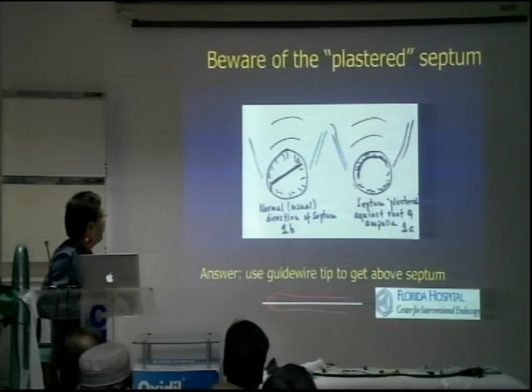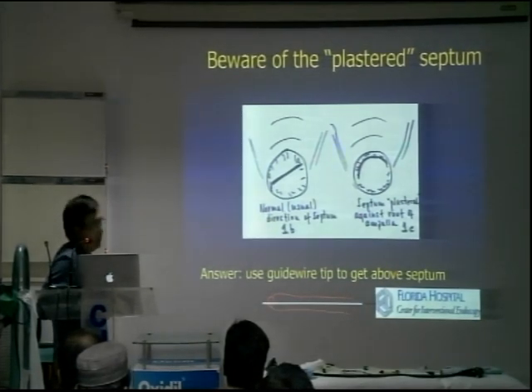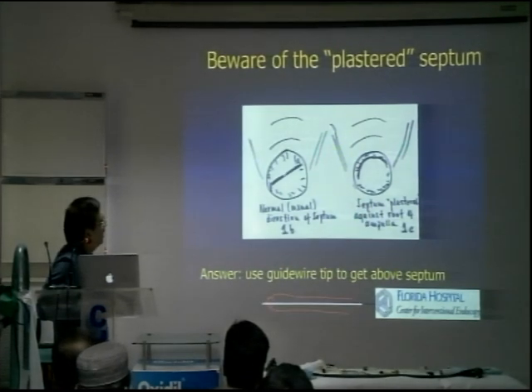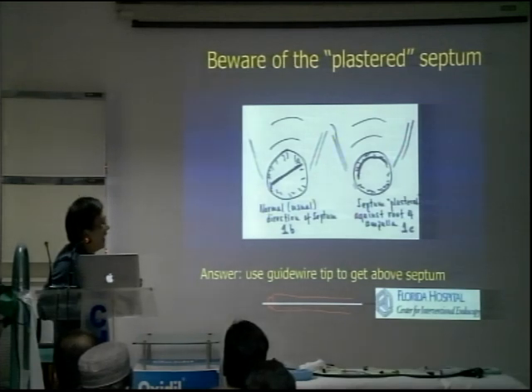So what happens is, let's suppose this is the papilla. This is the first position of the papilla. The septum is right in the middle, the bile duct is above that, and the pancreatic duct is below that. So you cannulate it, and you went straight into the PD. That is also the case with bile leaks, when the system is closed, and sometimes you just keep going into the PD.